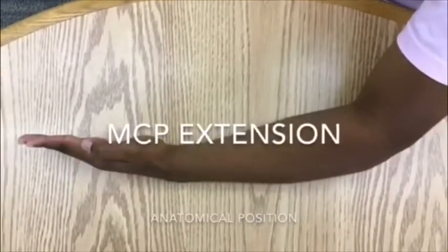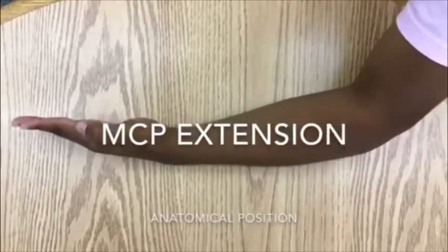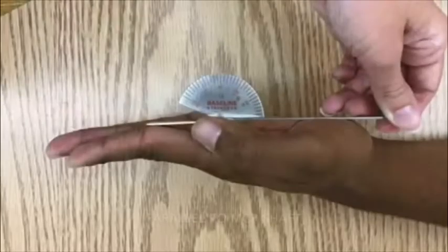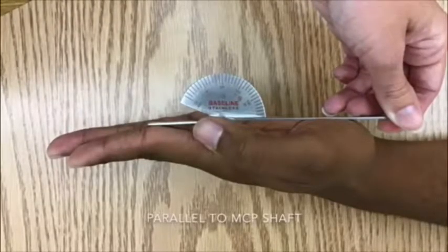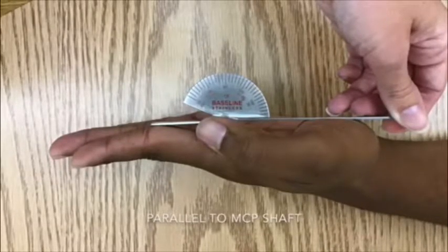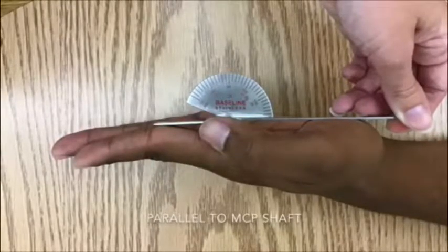To measure metacarpophalangeal joint extension, start in the same position as metacarpophalangeal flexion. Place the axis of the goniometer on the anterior aspect of the metacarpophalangeal joint, with the stationary arm again parallel to the longitudinal axis of the metacarpal.